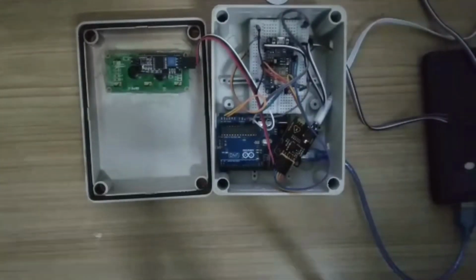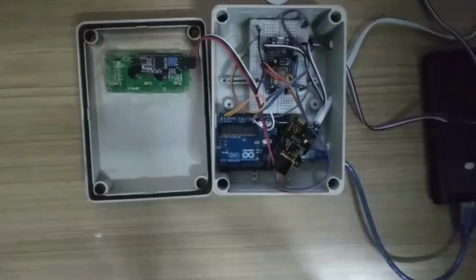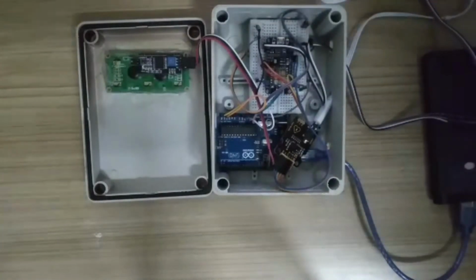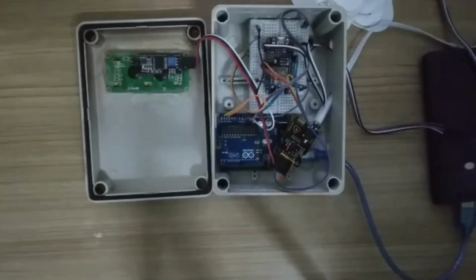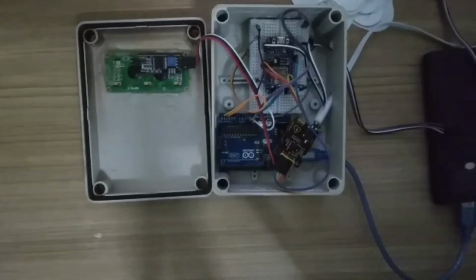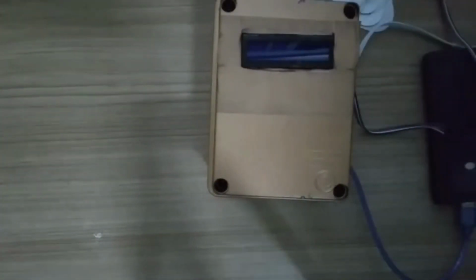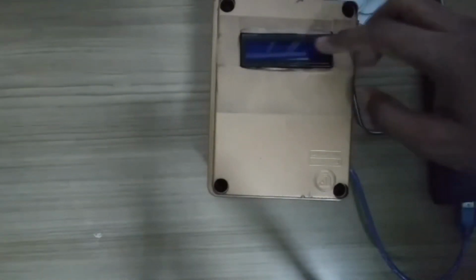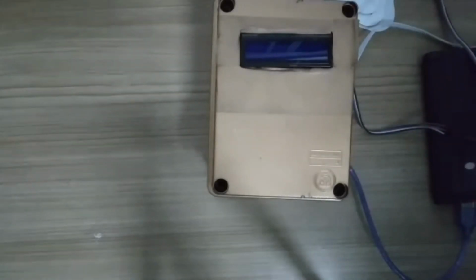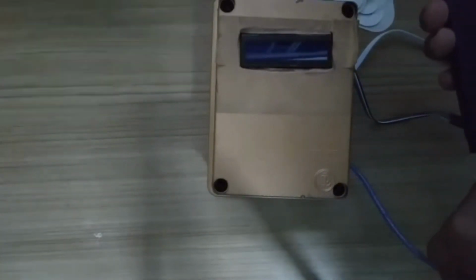Currently the ESP8266 will transfer data gathered from a heart rate module, which are from these health pads, and send this data to our app where doctors can monitor it on their phone. Furthermore, we are also putting in a display screen where the data will be instantly transferred for the doctors to monitor on the spot. We are also using a power bank to power our prototype module here.